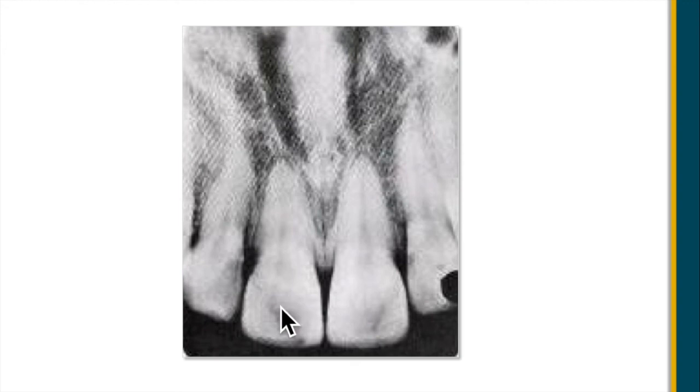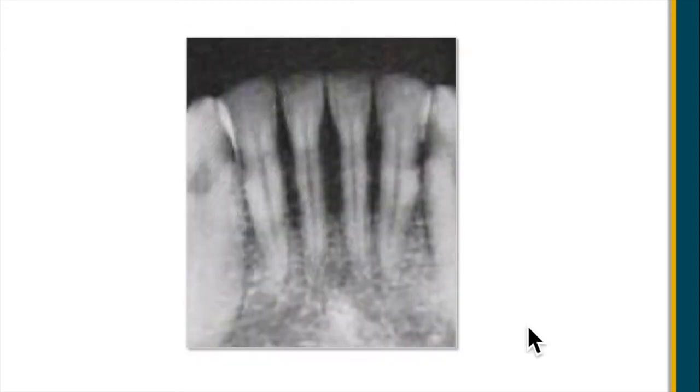Okay, so that's tooth number 8. That makes this one tooth number 9, 10, 7. Can you see the cavity here? And this is the bump that I was talking about. So that's not a cavity, that's a bump. That's where the film helps you identify the front and back of the film in the old systems.